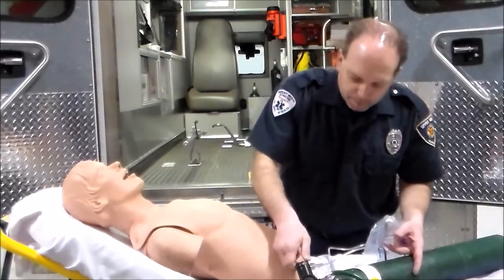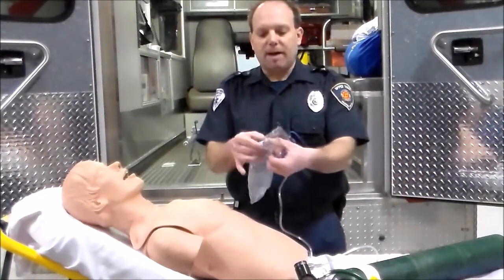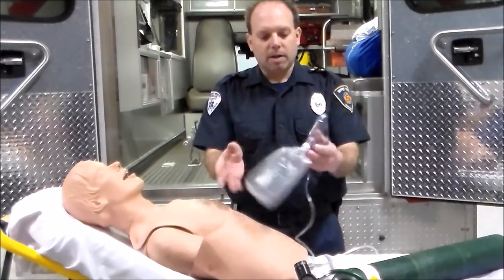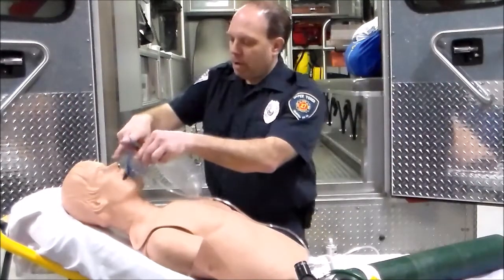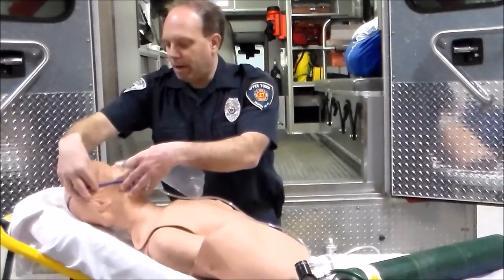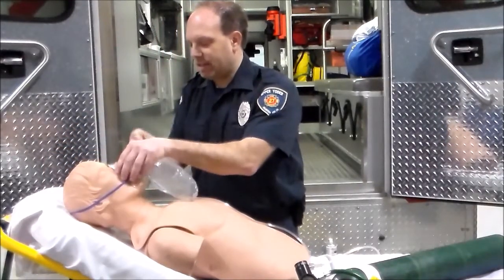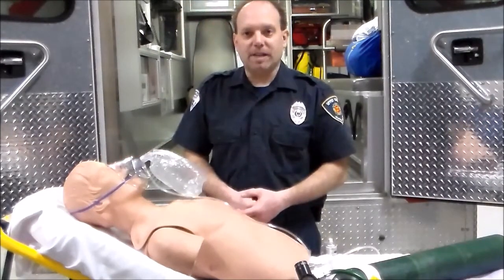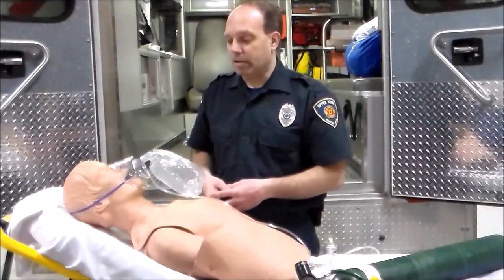I'm going to show you the whole part of it first. We increase this to 10 liters, then place a finger inside and inflate the non-rebreather bag. Once it is inflated, we come in and place this on the patient's nose and mouth, then place the band around their head and make sure it is all snug. I've now applied a non-rebreather face mask. We'll continue to monitor the patient to see how well they're doing after administration of oxygen.